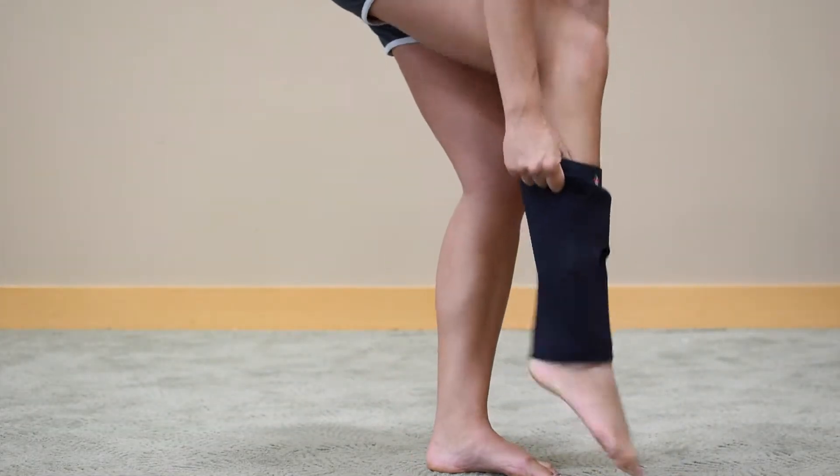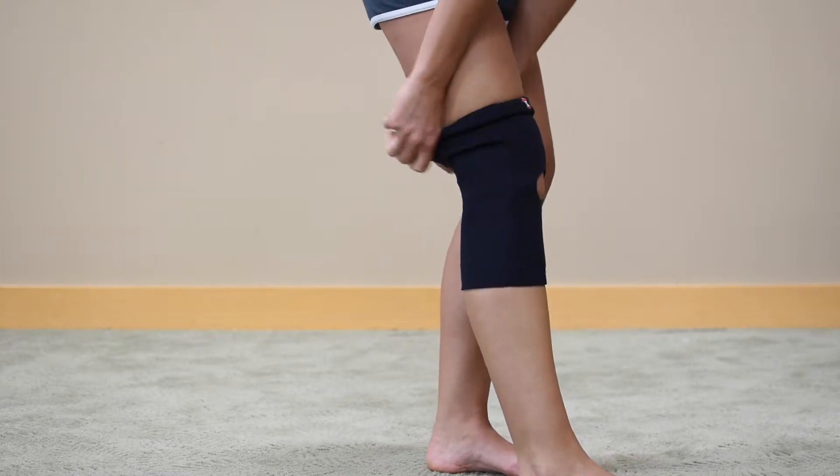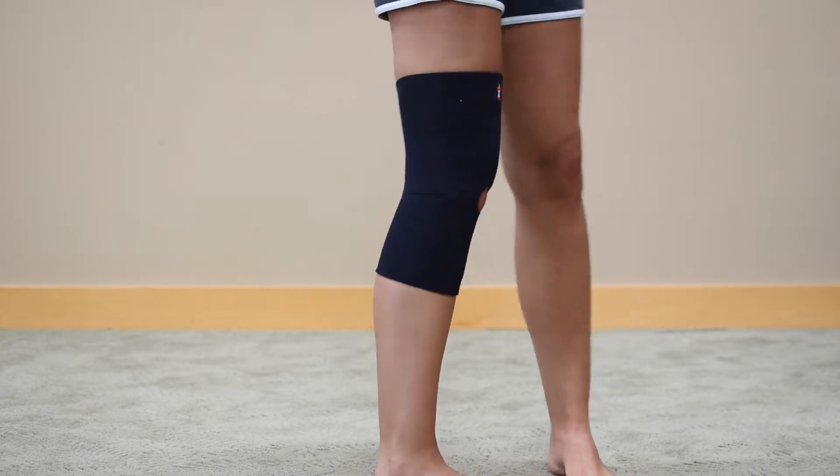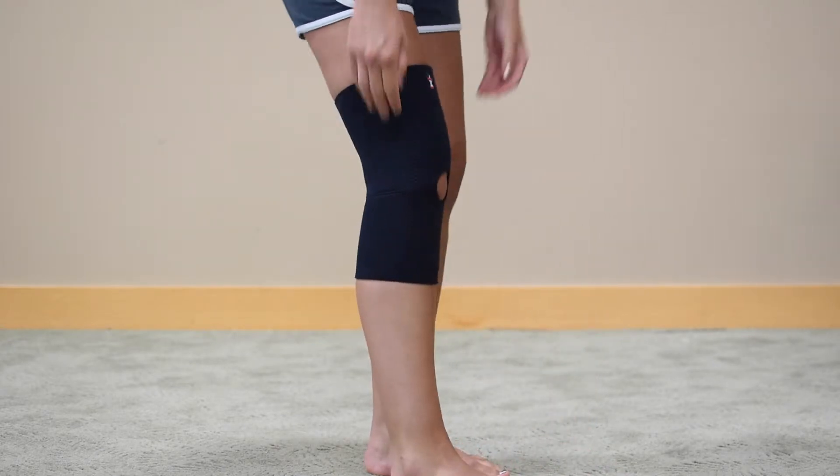Core Products Neoprene Knee Sleeve. A convenient slip-on support is great for edema or post-surgical effusion, mild osteoarthritis, and patellar tendonitis, which is also known as jumper's knee.